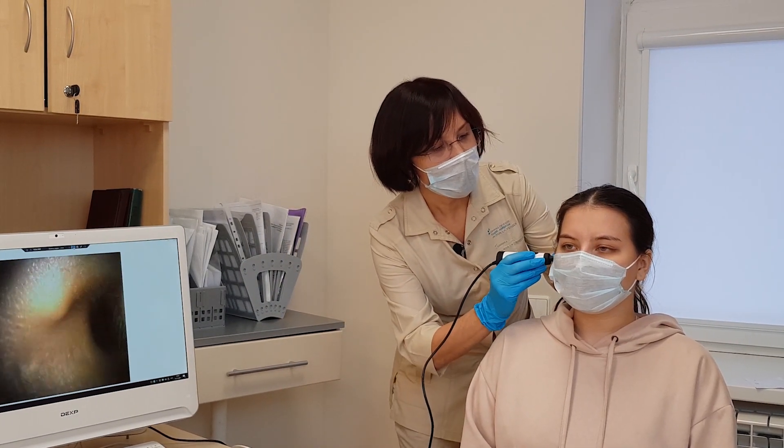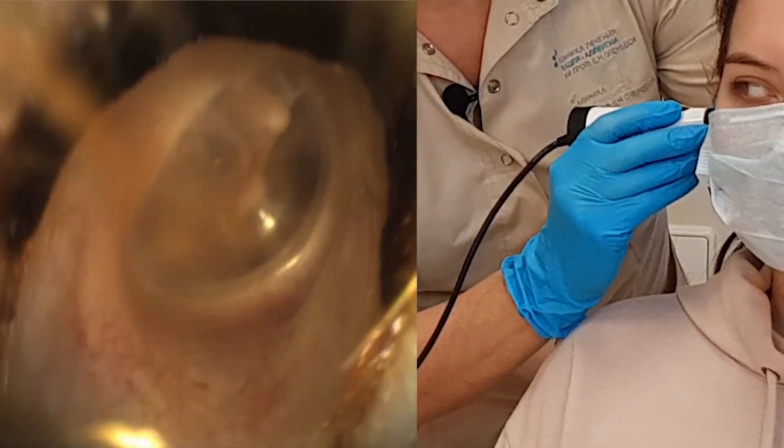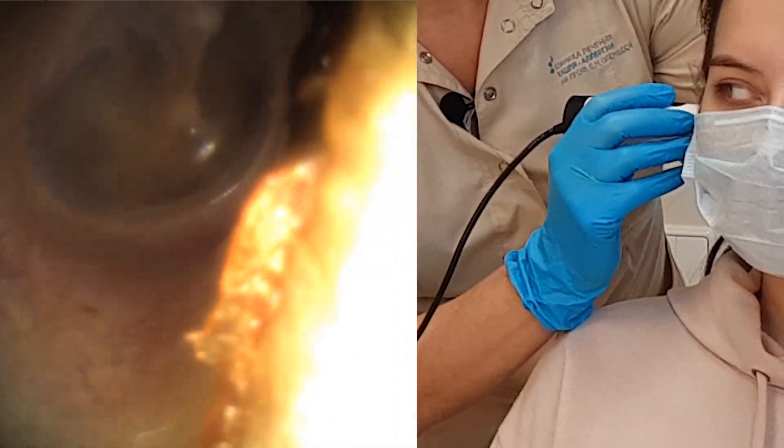For the first time, we'll put the endoscope into the ear of the patient. You can see the membrane, and we make a photo.